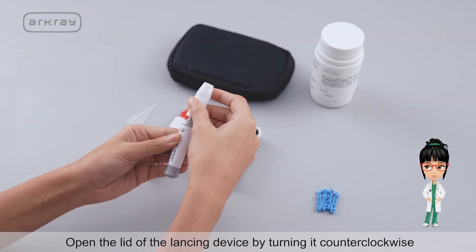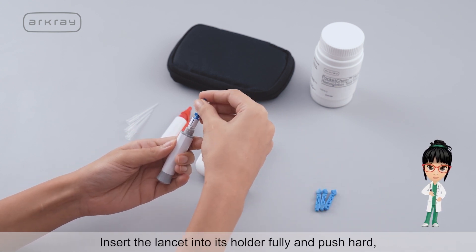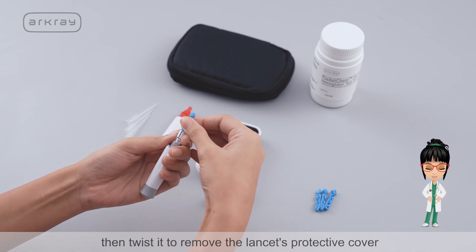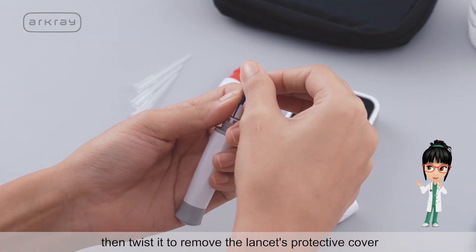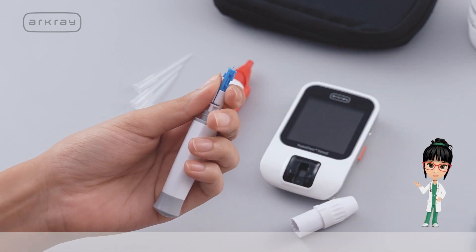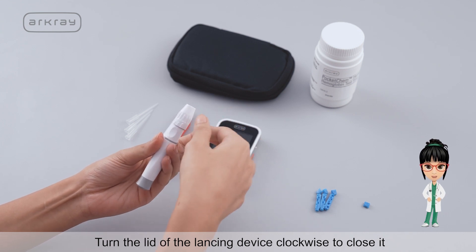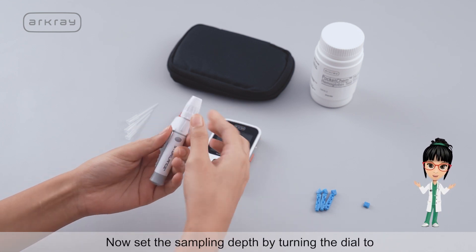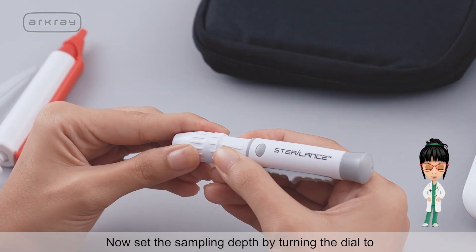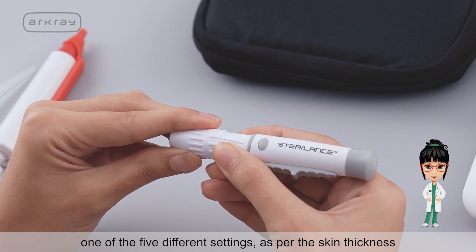Open the lid of the lancing device by turning it counter-clockwise. Insert the lancet into its holder fully and push hard, then twist it to remove the lancet's protective cover. Turn the lid of the lancing device clockwise to close it. Now set the sampling depth by turning the dial to one of the 5 different settings according to skin thickness.